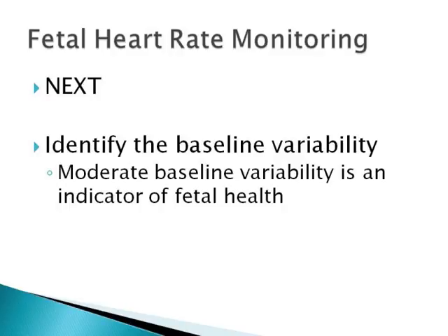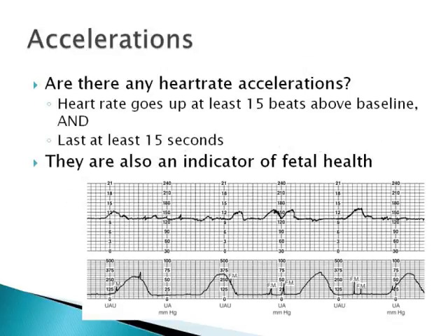Next, you look at the baseline variability, not the variable decelerations. We're looking at the variability of the baseline itself, and the presence of moderate variability is an indicator of fetal health. Similarly, accelerations are an indicator of fetal health.